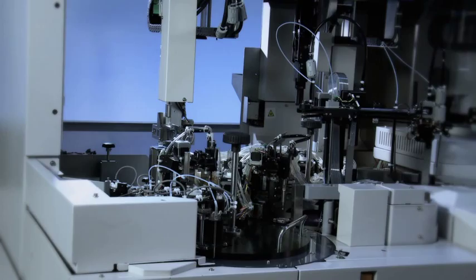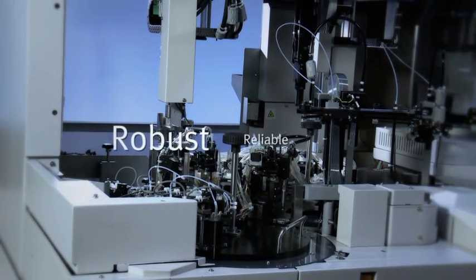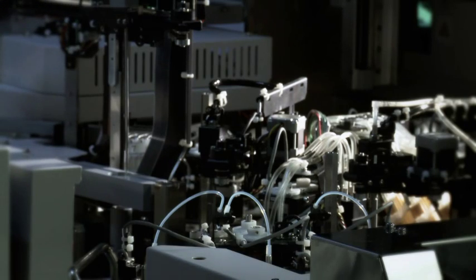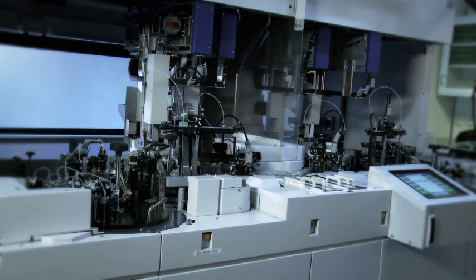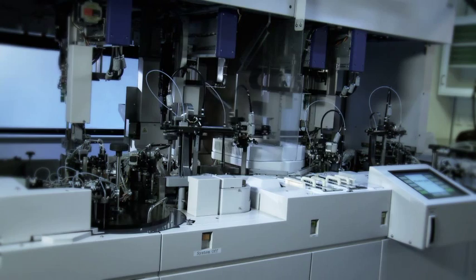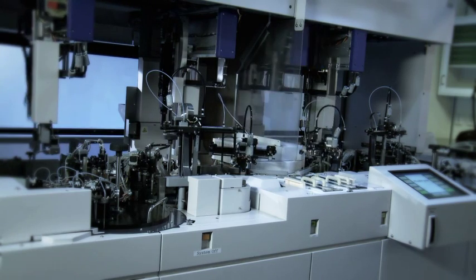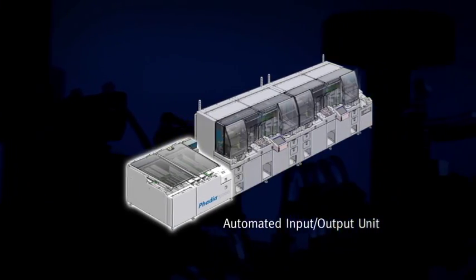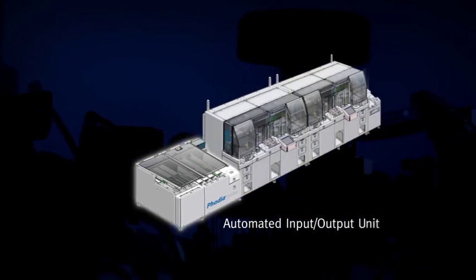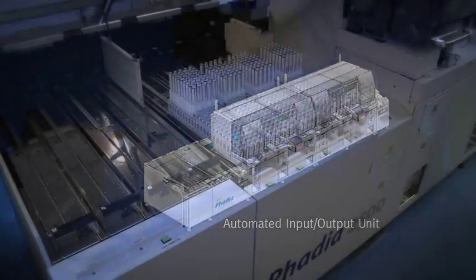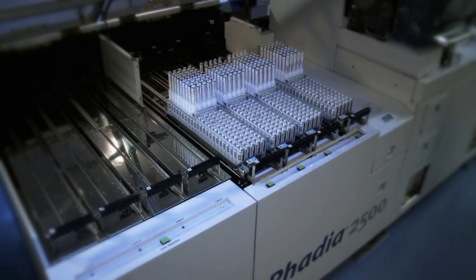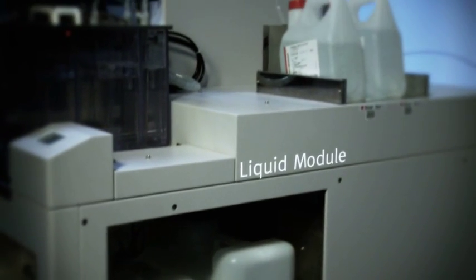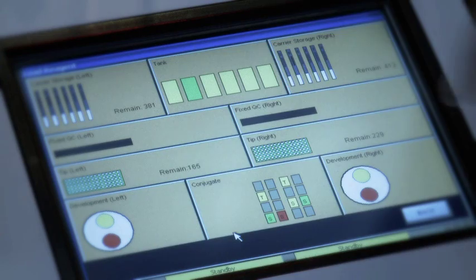FADIA 2500 and FADIA 5000 are robust and reliable, based on a proven technology commonly recognized as the gold standard today. To improve workflow and minimize hands-on time even more, we've added some new features. An automated sample input-output unit handles all your sample racks and also simplifies loading of many reagents. A liquid module will automatically prepare, distribute, and monitor the levels of washing solution.